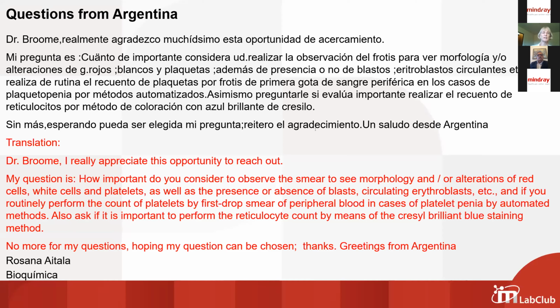Then you have to make a decision about what cutoff to use, how high a level of immature granulocytes warrants looking at the blood smear. We were pretty conservative on that. I think our cutoff was as low as 2%, but most labs, I think, use 5% immature granulocytes to decide to look at the blood smear.